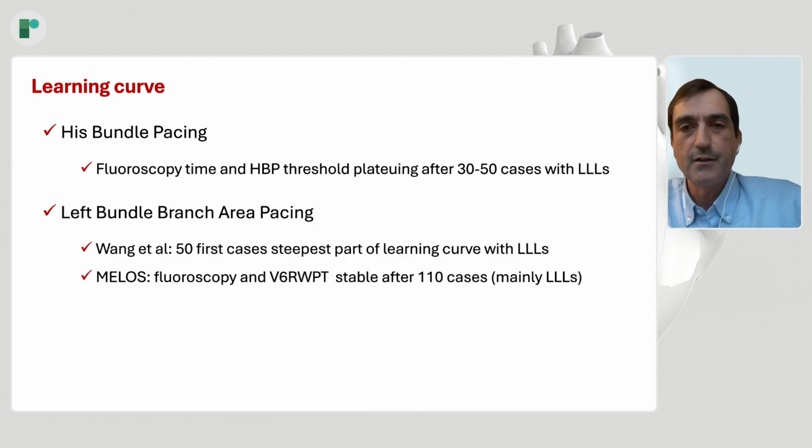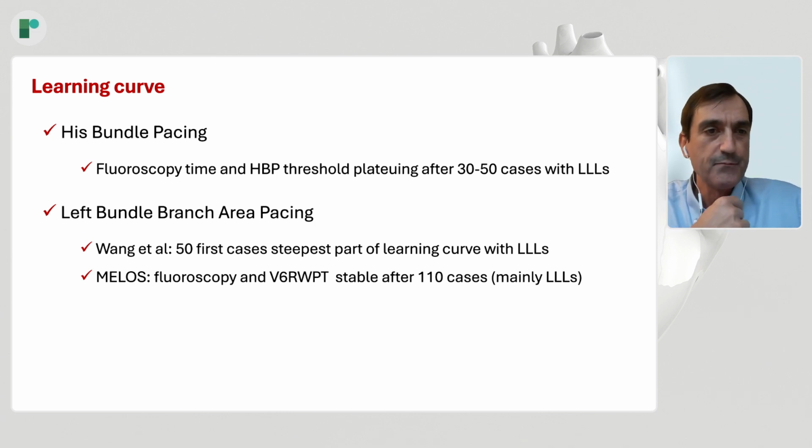Basically, we can see the evolution of the paced QRS morphology while we are penetrating the lead inside the septum.